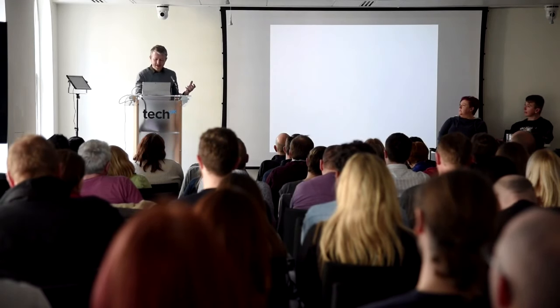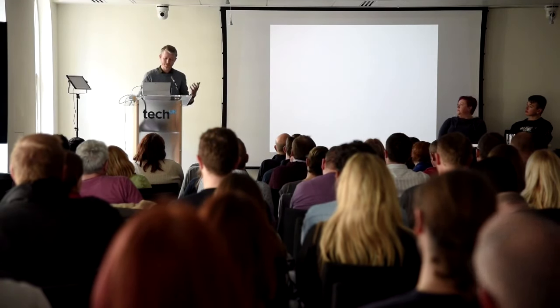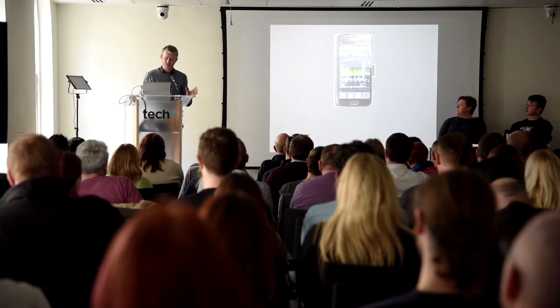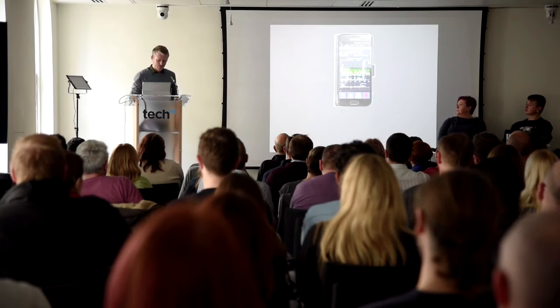There's the other barrier that I mentioned, which is "I won't be able to do it", the practical stuff that you need to have, that you need to set up. And first of all, it's called Android APS. You need an Android phone. Lots of them will work. This is the Samsung that I use at the moment, which was about £100 second-hand on eBay. You don't need a watch.